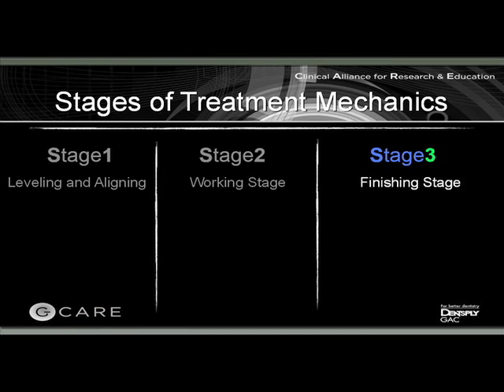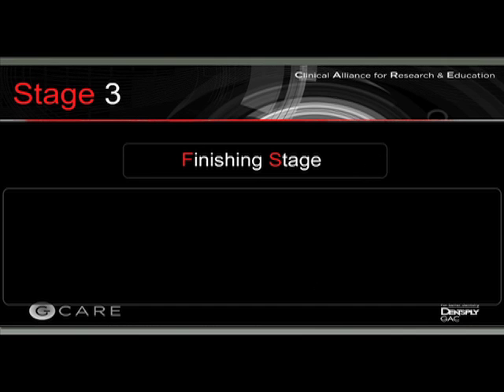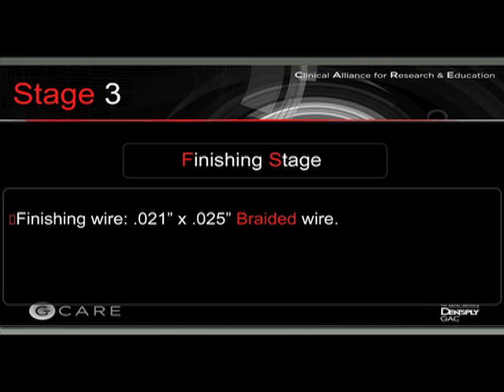Finishing stage, the last one, is when we fine-tune the occlusion, when we make those little changes just to have everything looking the way that we like. And usually I use a 21 by 25 stainless steel braided wire. The braided wire is a gray wire.